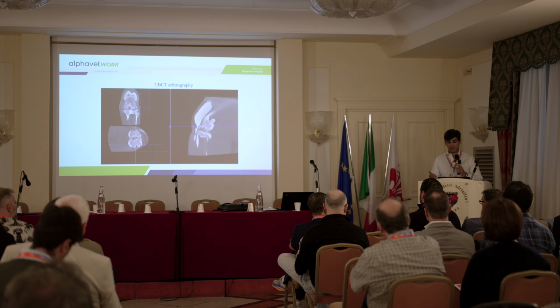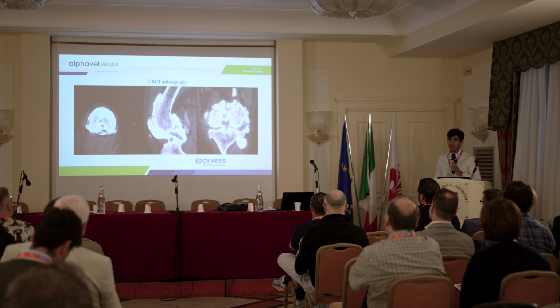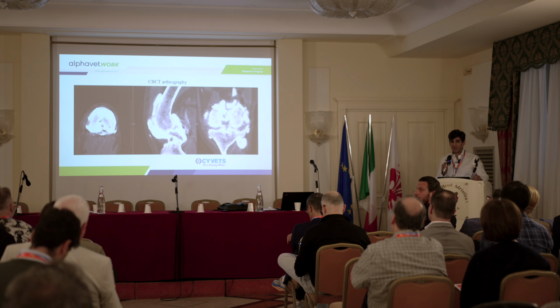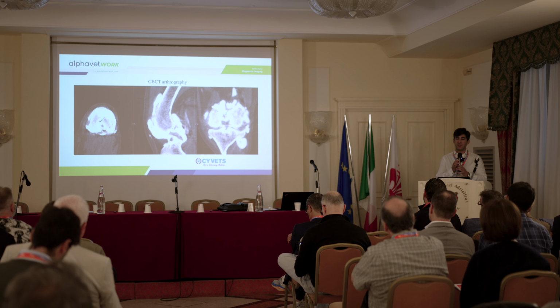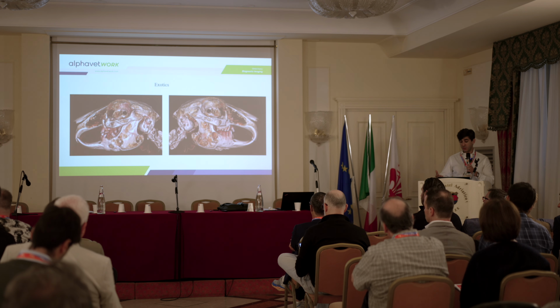And you need time. What we do now, with a friend of mine in Cyprus, is that we do all the stifles with CT arthrography. And after less than a year, I feel confident to say if you have a meniscal tear or not, or a rupture. I was not aware of that before. So this is something all the radiologists will have to be comfortable with, provide the literature, and then say to the vets, yes, you can do it, because we can report it, and then you can be sure.